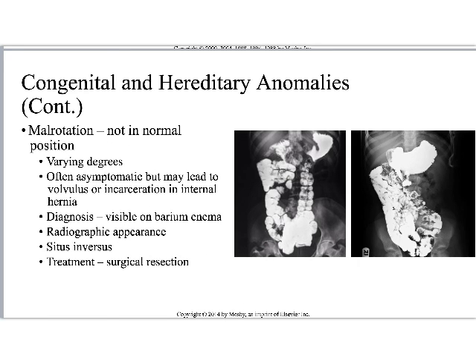And again, like I've said in the past, if I indicate that something is common, it means that you're going to see it quite a bit in X-ray. It also means that's good fodder for registry exam questions and good fodder for my exam questions, right? Because it's common. You can expect to see it a lot, and that's the stuff that we need to know. We need to know the bread and butter stuff.